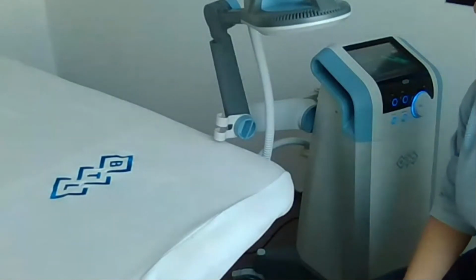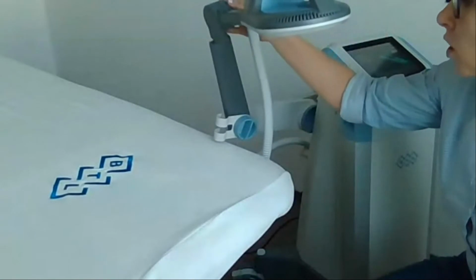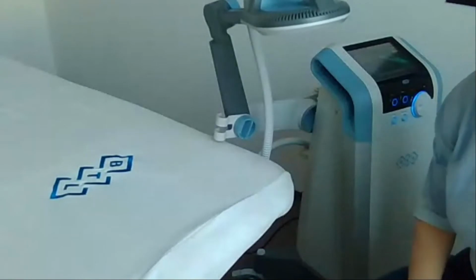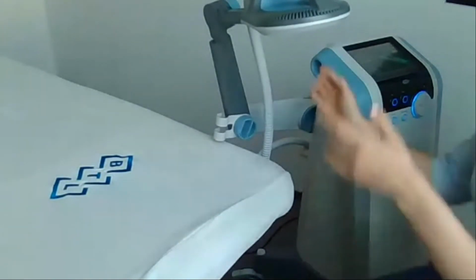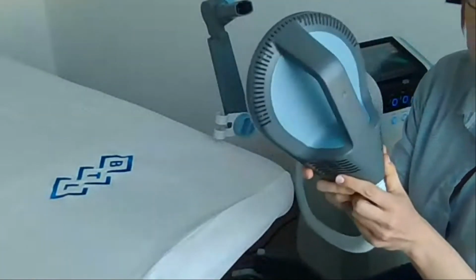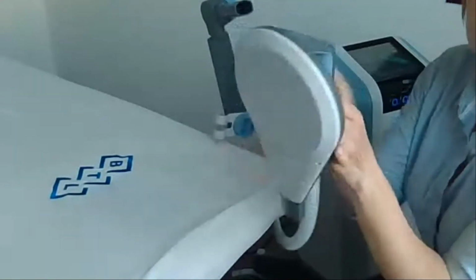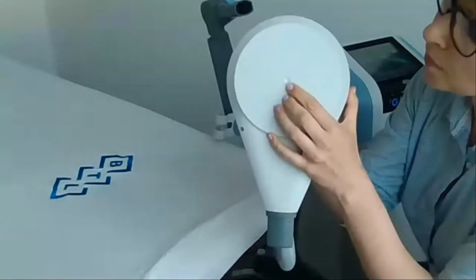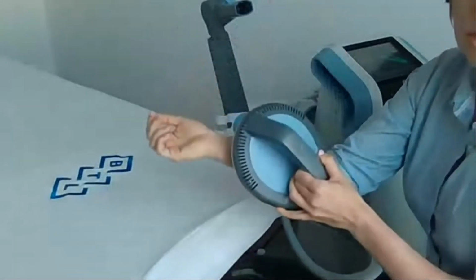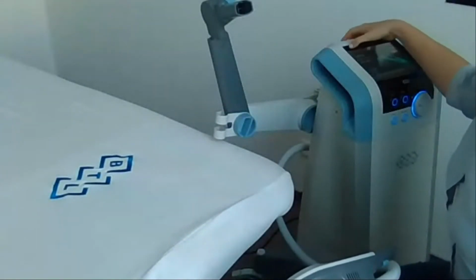So we can fully recommend to use the applicator on the 6-joint arm. It is very easy to change the position with the patients, but in case that I am now the patient and the therapist, I will just remove the coil, and I will show you that here, this is the center of the electromagnetic field, and also we can see it here. And this is the point we are focusing on, to cover the motor point we want to reach.